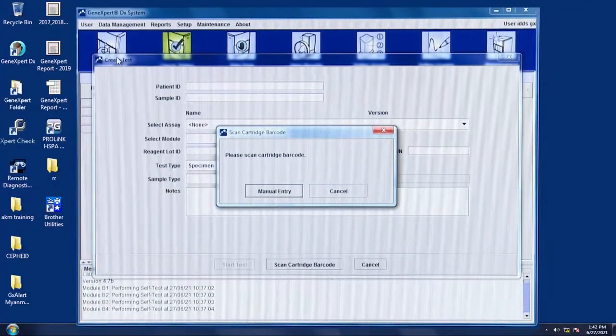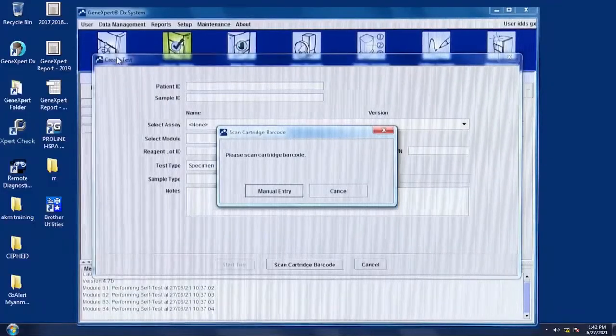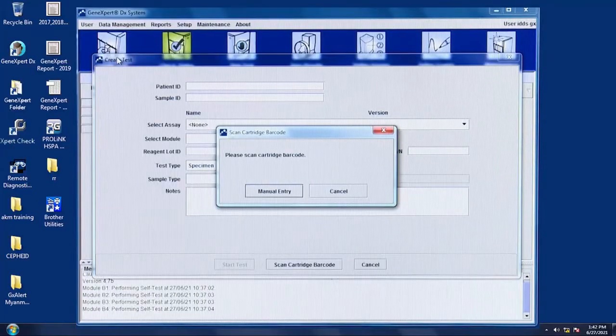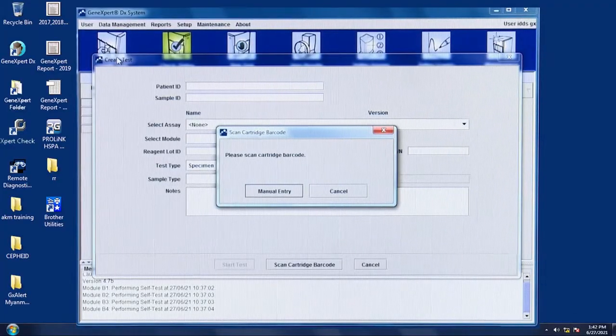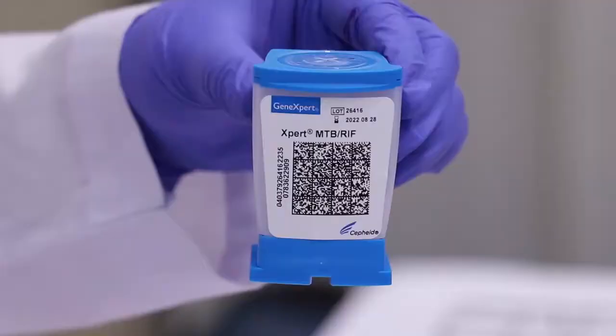If the cartridge barcode can't be scanned due to damage to the barcode, it can be entered manually into the software. To do so, choose Manual Entry. The Scan Cartridge Barcode window appears. Then, put the numbers on the left side of the barcode without space and enter.